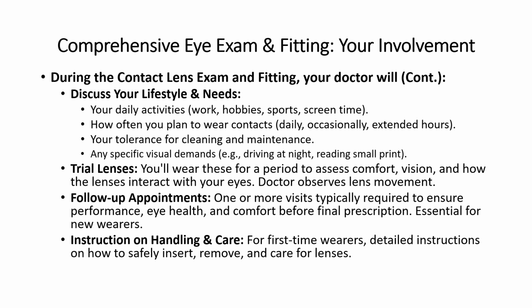Continuing the contact lens exam and fitting process, your personal input is vital. Your eye doctor will discuss your lifestyle and needs, asking about your daily activities, how often you plan to wear contacts, your tolerance for cleaning and maintenance, and any specific visual demands you have. Based on all these factors, your doctor will select initial trial lenses. You'll wear these for a period, from minutes in the office to a week at home, to assess comfort, vision, and how the lenses interact with your eyes. The doctor will also observe the lens movement on your eye.